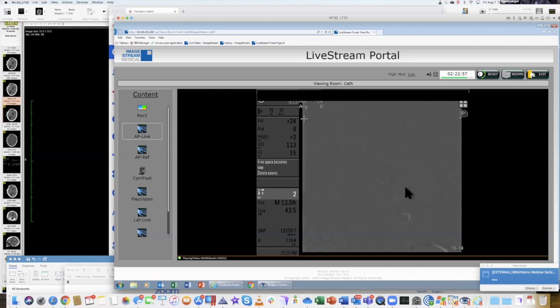He's probably loading up another coil now. Here comes a coil. Here it comes, here it comes. Now it's coming out of the tip of the catheter. He's pushing it, he's pushing it.